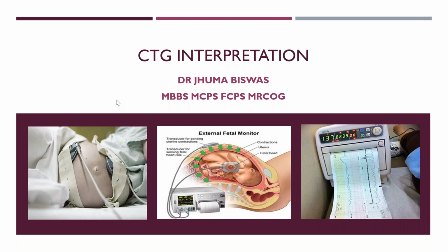Today I'm going to discuss a very important topic, that is CTG interpretation. This is part of the labor ward module, but it is very important because I realized most of the students fail in interpretation of CTGs, and most of the students fail the labor ward module.